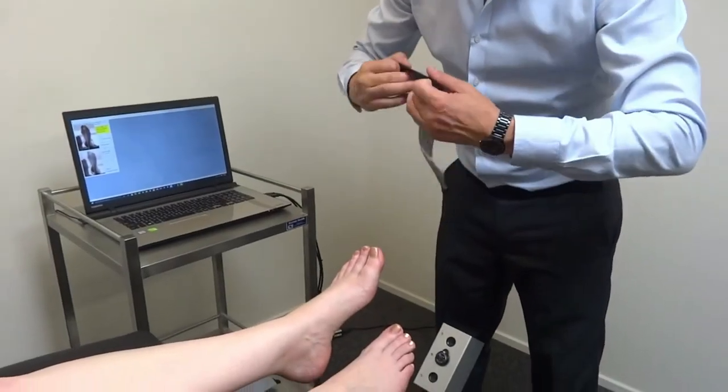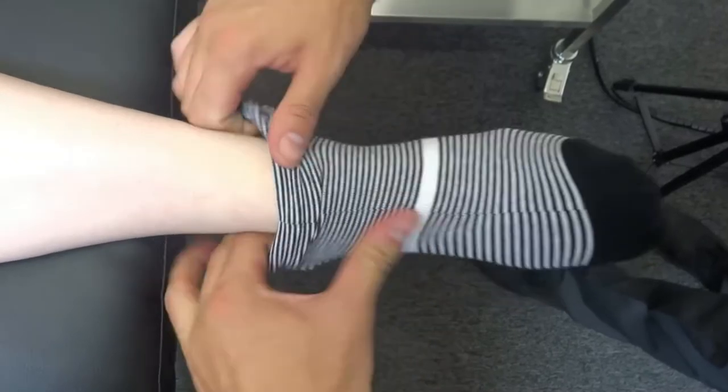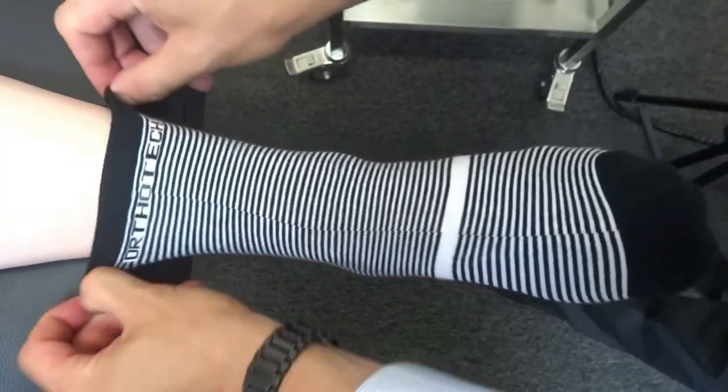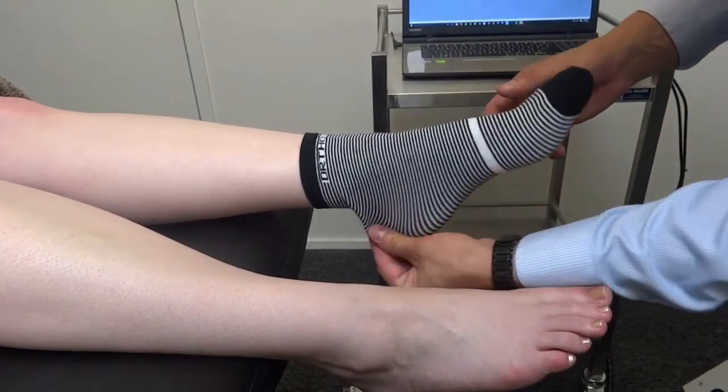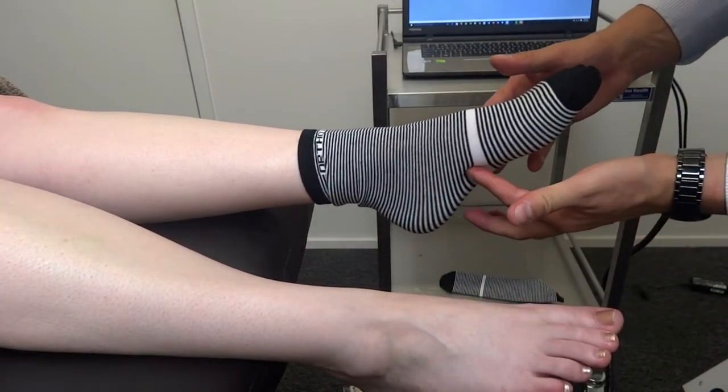There is one seam beneath the Orthotec 3D logo and we want this on the dorsal side of the foot. Put the sock on like we would a normal sock and make sure it's not too tight. If it is too tight, as shown here in the picture, we'll get a bowing between the metatarsal heads and the calcaneus, and the sock won't contour to the arch.